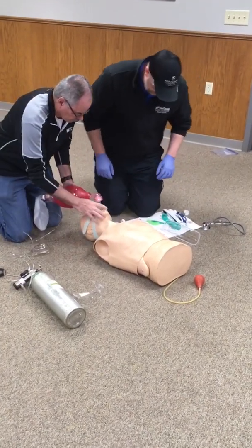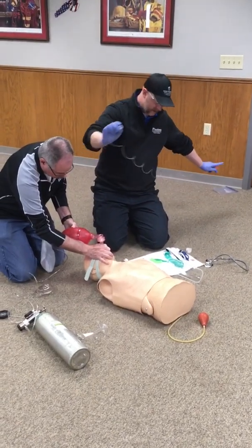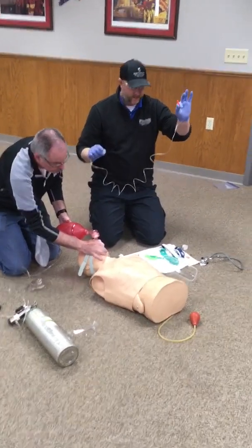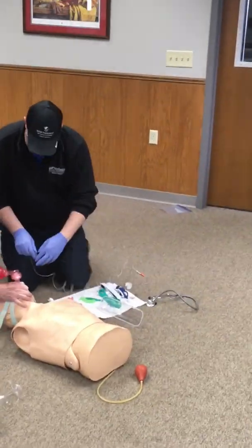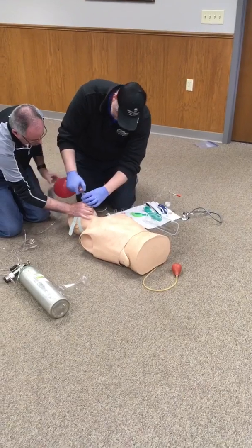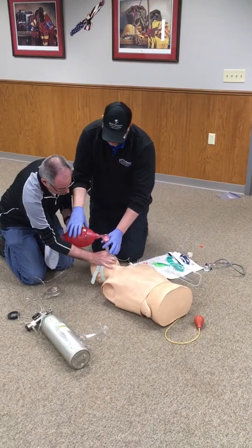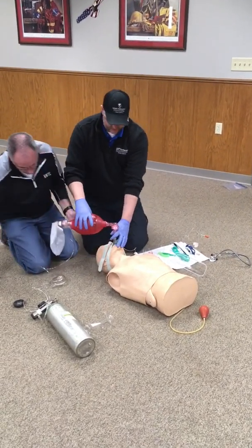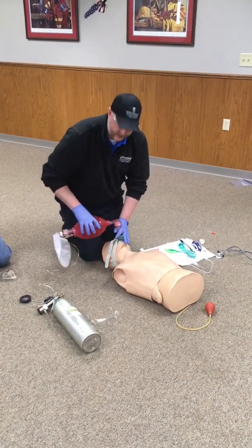Once that's in place, I'm going to go ahead and attach my capnography — this would of course be attached to whatever device you have — to verify by secondary means that we have good insertion. Then I can go ahead and take over ventilations, continuing to ventilate one breath every six seconds.